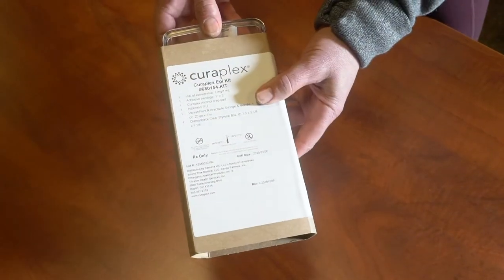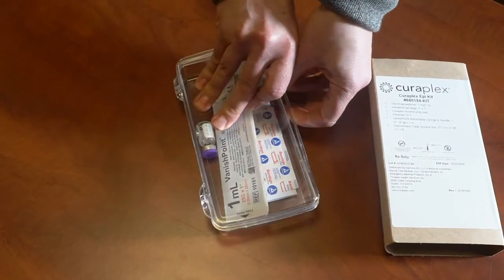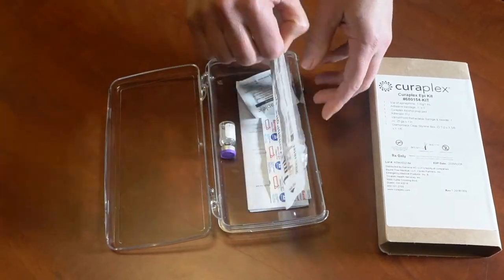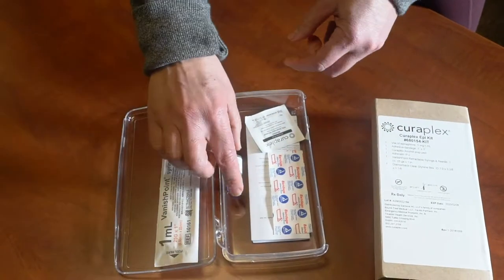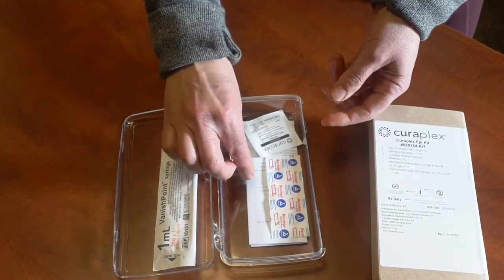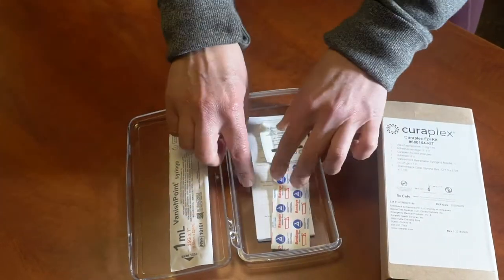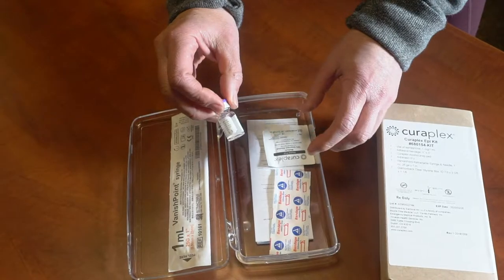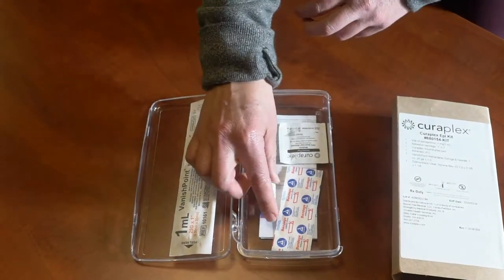Alright, so this is what the kit looks like now. It's made by Curaplex. Once you open it up, there's going to be a new updated syringe — we'll talk about that in a second — and then the epinephrine, alcohol, and Band-Aid as before. Make sure you check the expiration date.